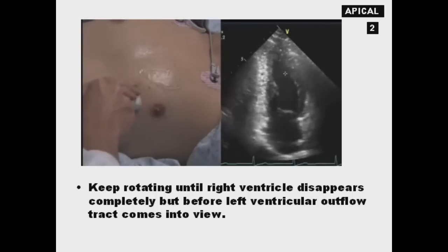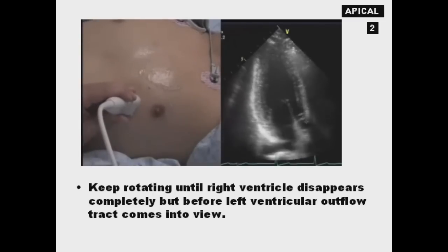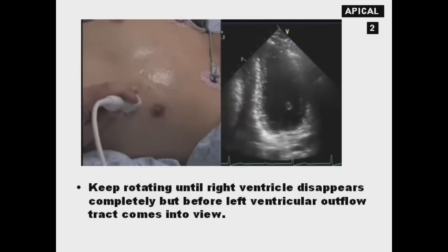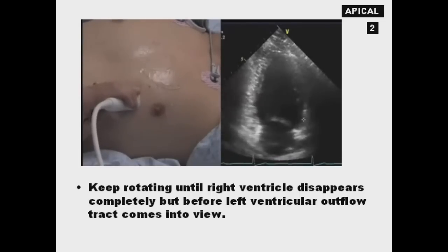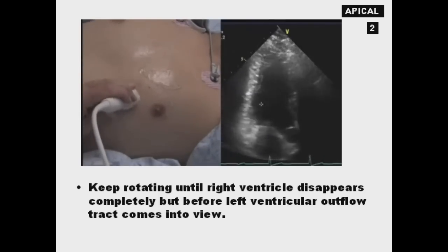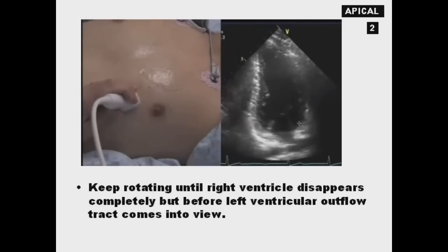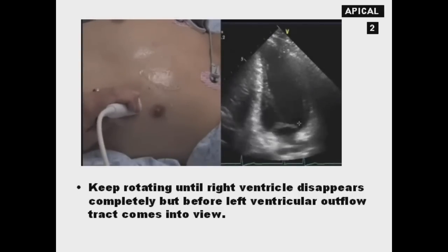Now, if this is a difficult view, it's often very helpful to go ahead and rotate all the way to see the aorta come in. Now we know we've over-rotated for the two-chamber, and if we rotate back a little bit, now we know this has got to be the right place. If I'm under-rotated, then I'm going to see the right ventricle coming in. So this is under-rotated, and this is over-rotated. So you just want to be right in the middle. No RV, no AO. And now we know we've got a good apical two-chamber view. And in this case, we've got a really nice apex.